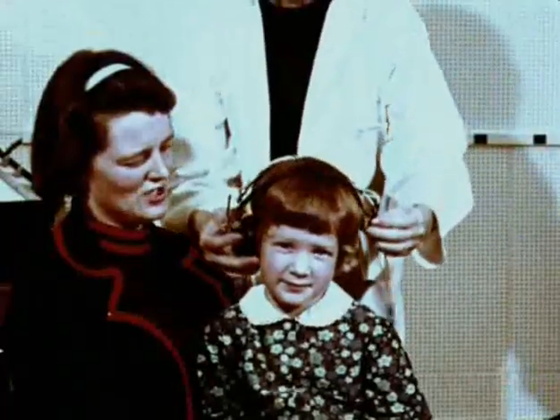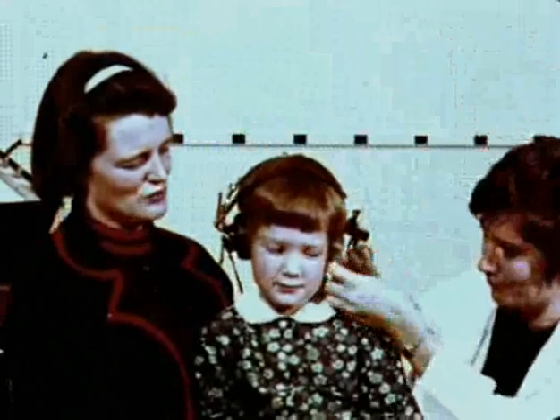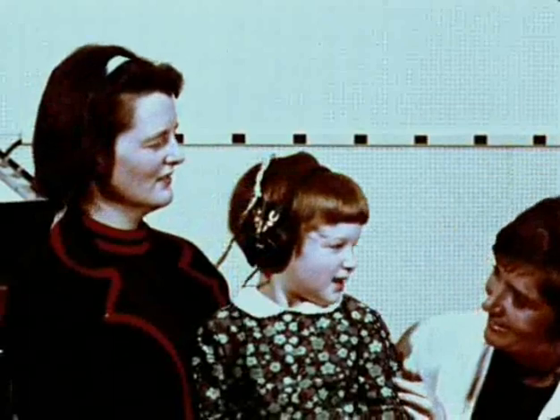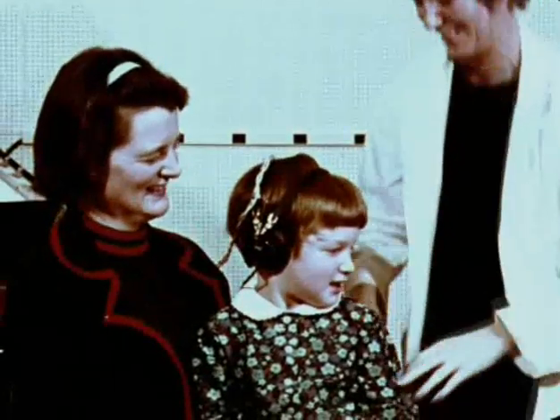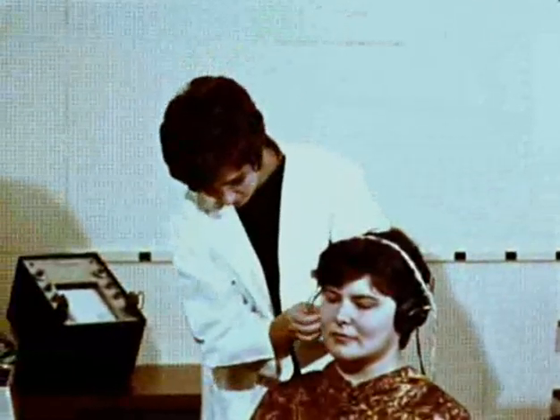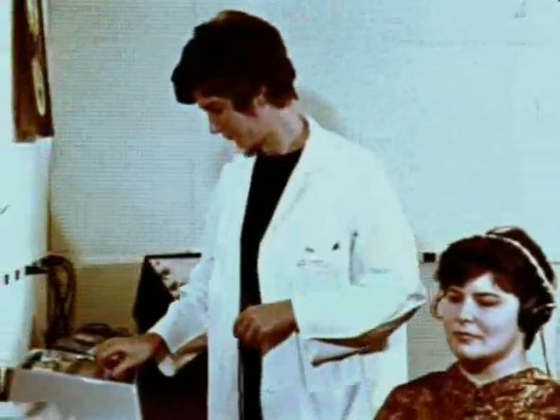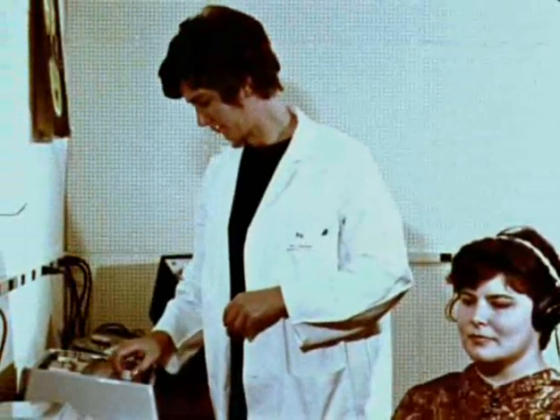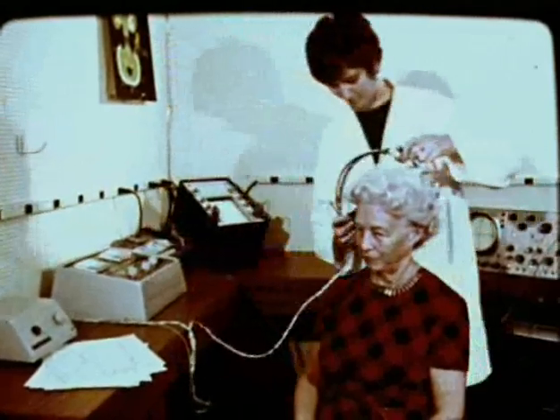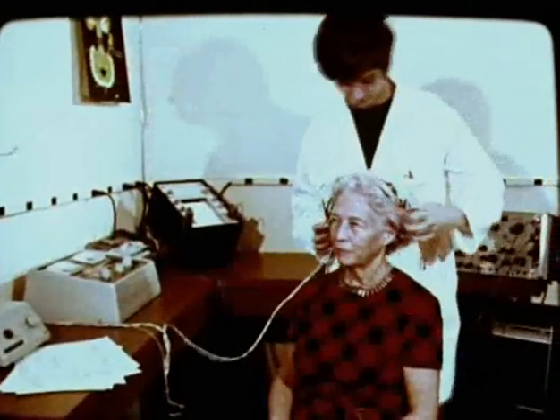As an adjunct to conventional audiometric techniques, this instrument provides considerable additional information and is simple to operate. Young children tolerate it well, and here it is helpful in determining the presence or absence of hearing and the presence or absence of fluid in the middle ear. It assists in the differential diagnosis of conductive deafness and is of great value in unraveling the diagnostic labyrinth of sensory neural hearing loss. It establishes the presence of cochlear irritability quickly and easily.